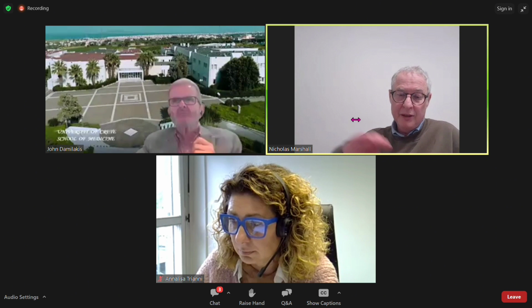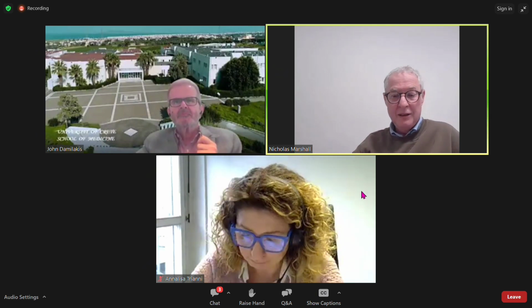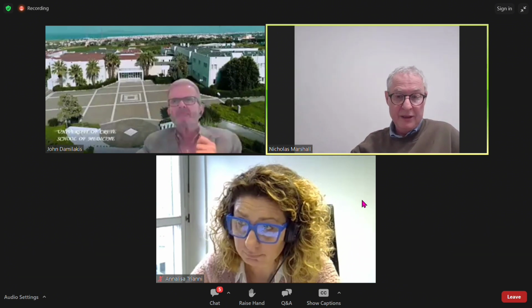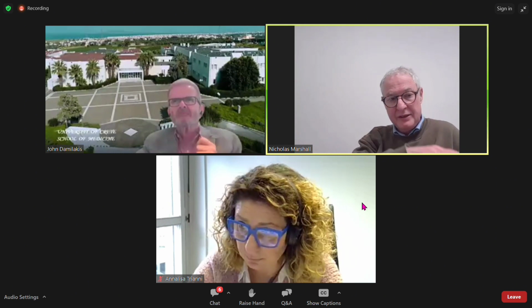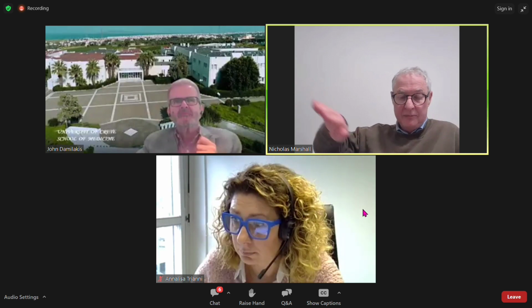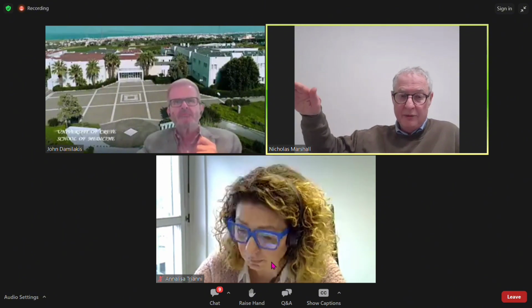And then there'll be a point where you'll have very high quality images, very low noise, very good contrast, very high patient dose probably, where you effectively have too much information in the image, and your task performance doesn't improve to any great degree, and then you're operating at too high a dose. So you see these graphs where you go up a certain curve, in a region where task performance and technical parameters like contrast, noise, resolution, etc., are affecting the performance. And then you get to a point where it flattens off.